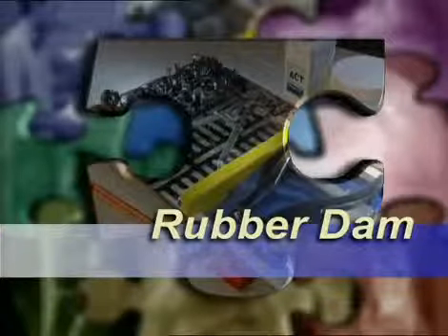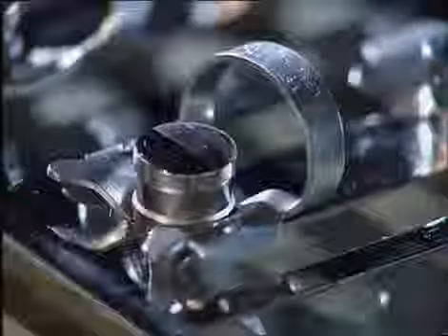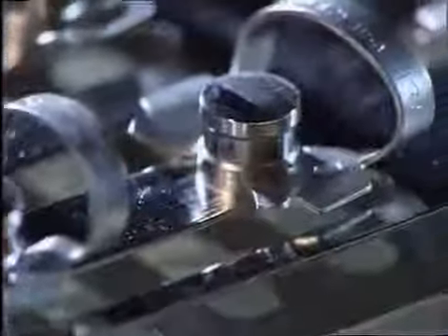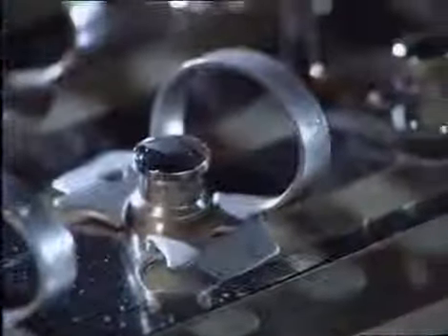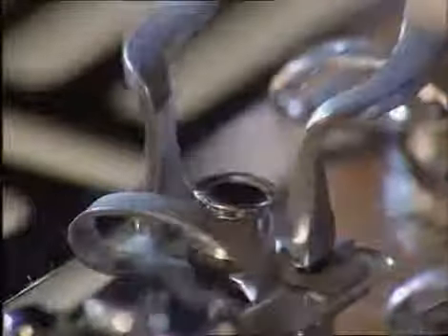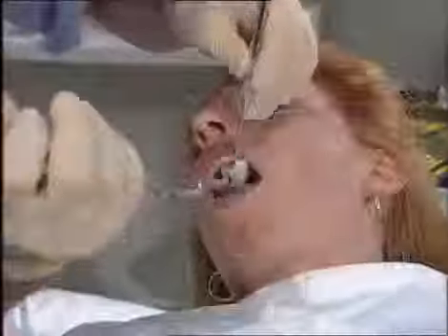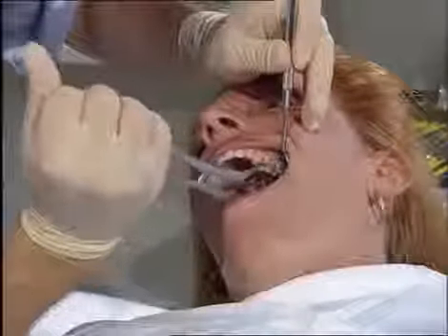Rubber dam isolation is the standard of care in endodontics. In endodontics, we just need a basic set of rubber dam clamps. The rationale for the use of rubber dam is patient protection from aspiration or the swallowing of instruments, medicaments, or irrigating solutions. It provides a surgically clean operating field, isolated from saliva, hemorrhage, and other tissue fluids.